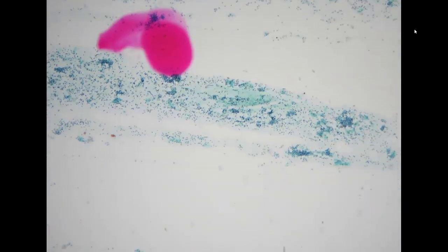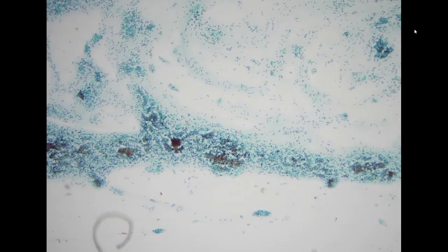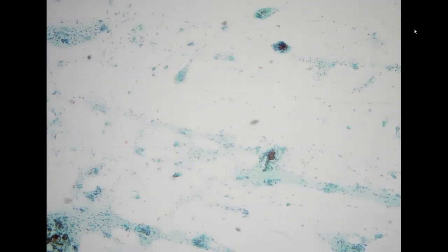On low power, it looks just like a usual atrophic Pap smear, a little bit dirtier. It's not very obvious whether there is any blood or endometrial debris, but just inflammatory cells.